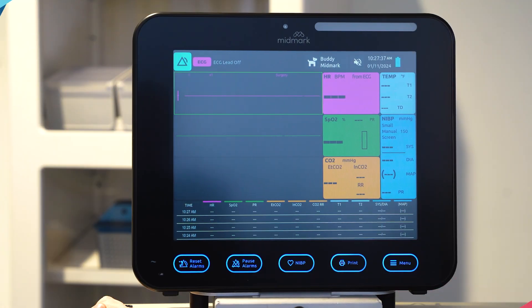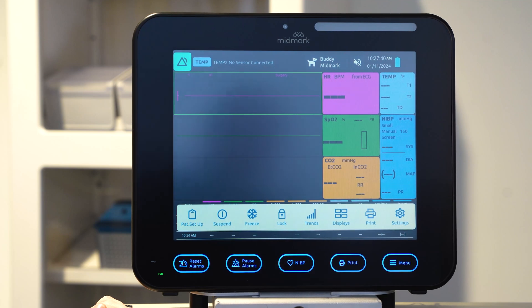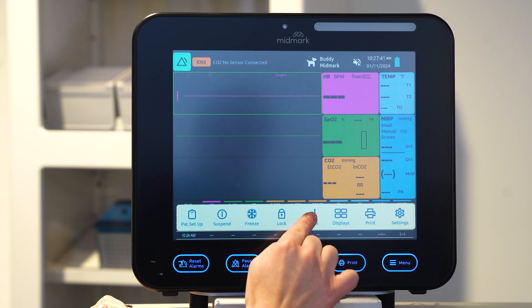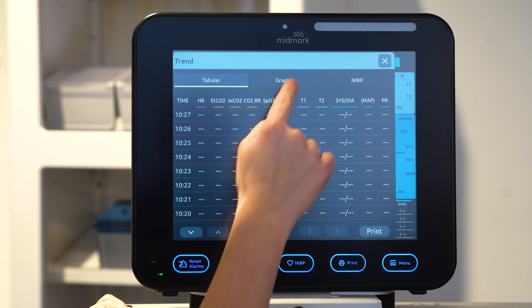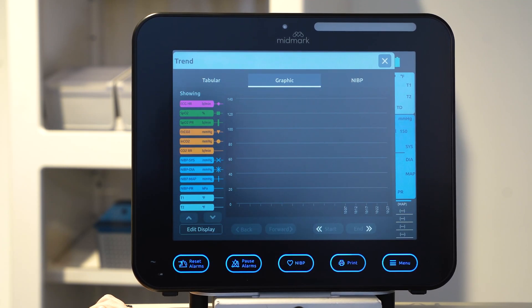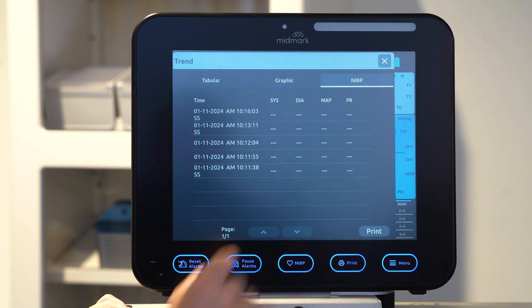To view patient trend data, select the menu, then trends. Data can be viewed in tabular, graphic, or NIBP views.